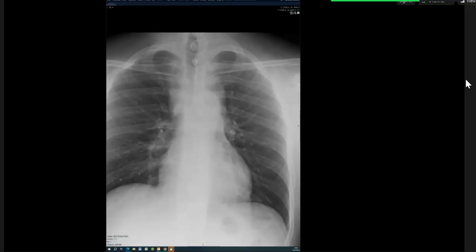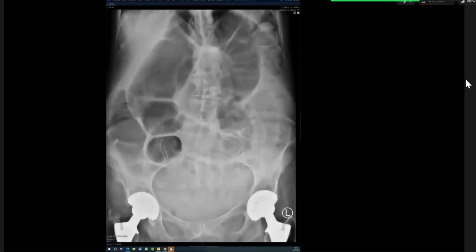Okay. Do we have candidate number 2? Good evening, Dr. Sumabia. Can you hear me well? Hi. You ready to start? Yes. Can you hear me well? Yes, I can. So let me bring up your first case. Okay. Can you see the screen? Yes. Okay. Have a go.